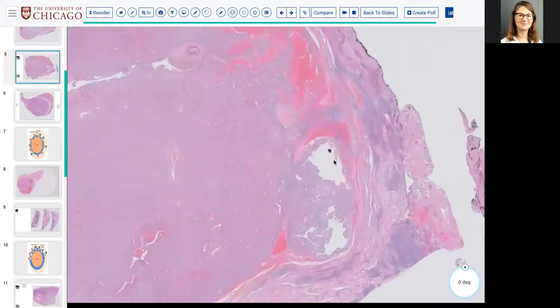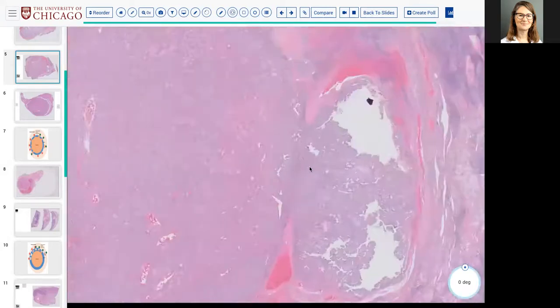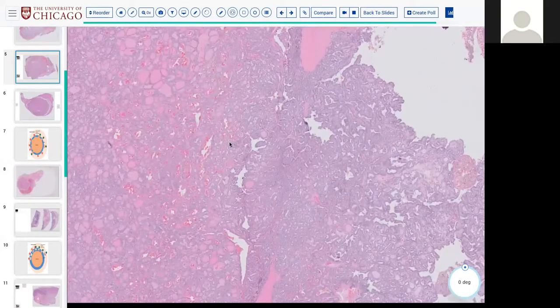It sort of depends where you draw the line, right? True. It's like it's budding off of the follicular carcinomas that kind of bud out, basically. But yeah, do you draw the line here or do you draw the line here? You're right, there's this weird bud. Were they colliding? I don't think they're colliding. I think this is all the same tumor. It essentially connects, like pooching out of there, yeah.